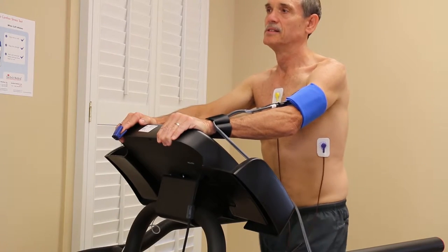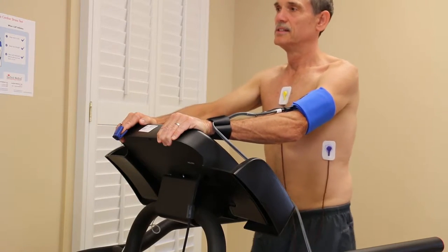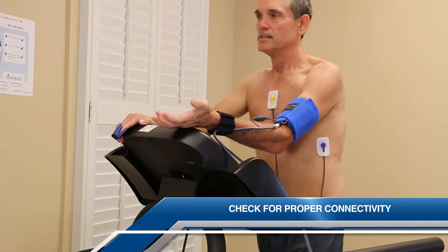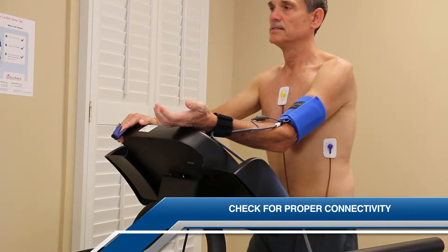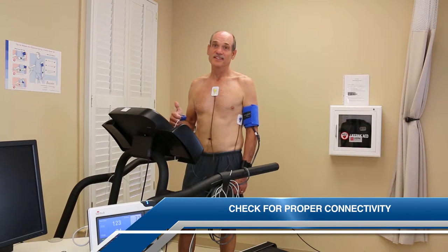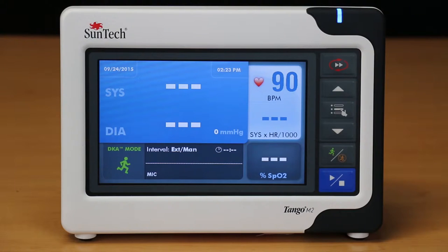One of the most important things you want to know about your Tango M2 is whether or not it is connected and communicating properly with your stress system. In this video, we will show you how to check for proper connectivity, but please make sure you have an actual person ready to perform a stress test before continuing. The first thing we want to verify is that the Tango M2 is displaying a steady heart rate reading after you have correctly applied the ECG leads of the stress system to your patient.